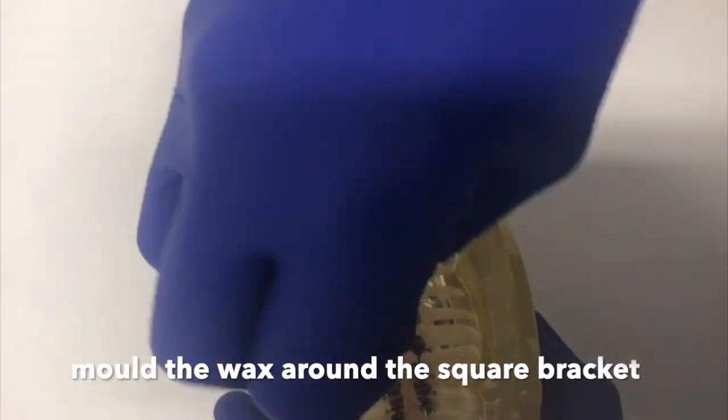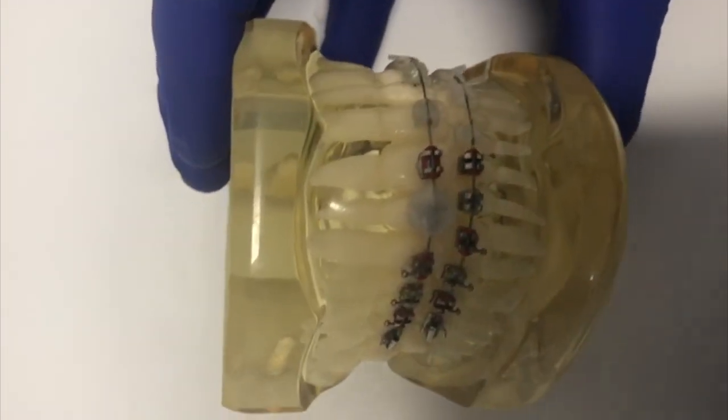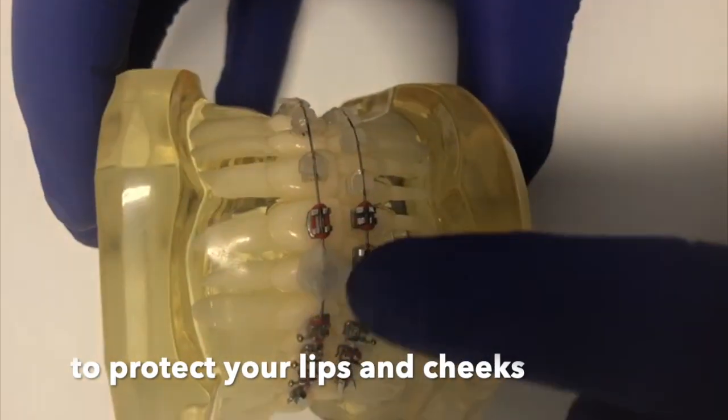This will just help it stick on a little bit better. Mould the wax around the square — don't worry about pushing too hard, it will not break the brace. All it will do is create a nice soft cushion to stop any little brackets rubbing on the inside of the lips and cheeks, especially if there's already a sore spot present.